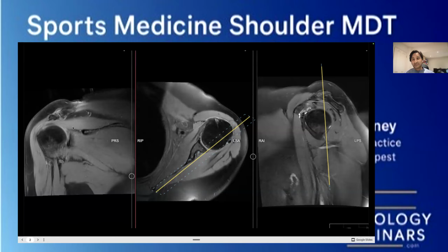And the osteoarthritis is defined by a few different things, especially on MRI scan. You're going to get subarticular bone marrow edema. So if we look at that, yeah, it does look a bit bright around the articular surface and around the bone. So that must be the subarticular bone marrow edema. We've also got these little indentations, outpouchings from there. That must be osteophytosis, which is another thing that can be a sign of osteoarthritis. And we could also say there's a bit of loss of joint space. So there's a few things here that make you think there's osteoarthritis.